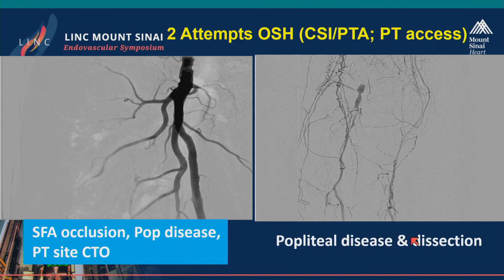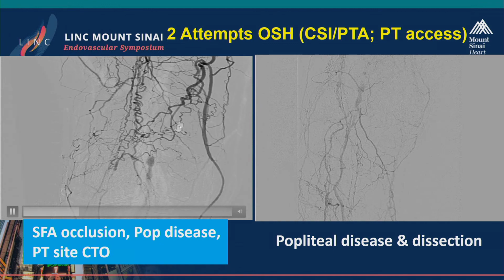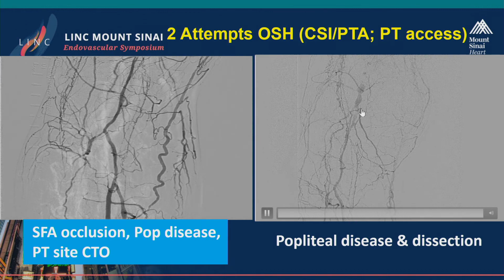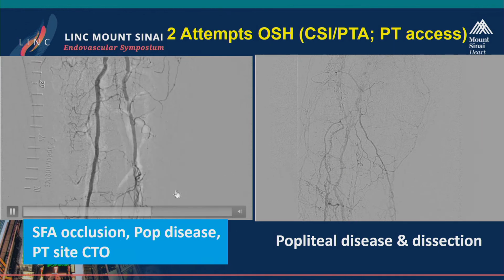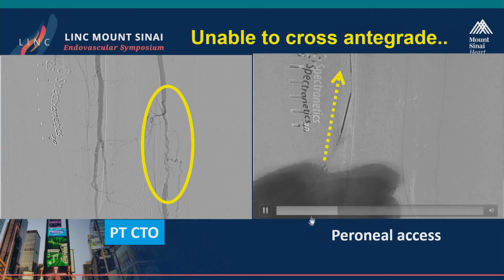and we're able to get flow back in a good bifurcation. Here's somebody who had a couple failed attempts at an outside place, and they had dissected this pretty badly. You can see there's additional popliteal disease and dissection from their first work, and they had gone posterior tibial, and there was an occlusion there, a PT occlusion where they had worked before.